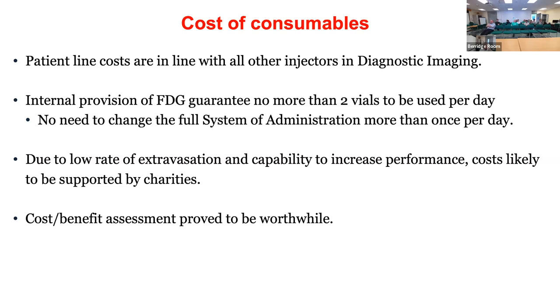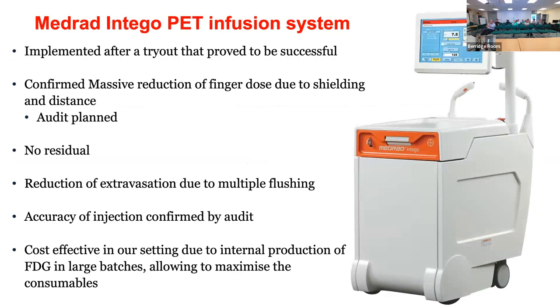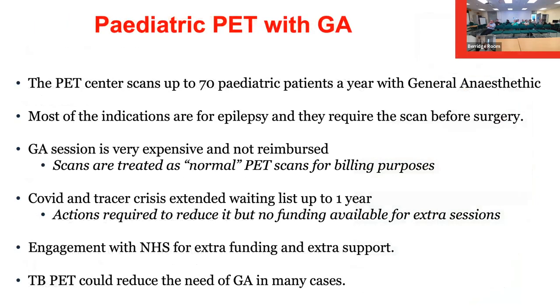We cannot open a service and at the same time expect an increase, because the point when the total body PET will be available, there will be a massive demand to use it. We will need to be prepared to increase the output immediately when it is delivered. This is what we have done in implementing that, and being sure, before we had the crisis of having the extra output, that we have a system. I presented this part to confirm how much you need to plan in advance when something happens, to ensure that the output of the images is actually clinically effective.